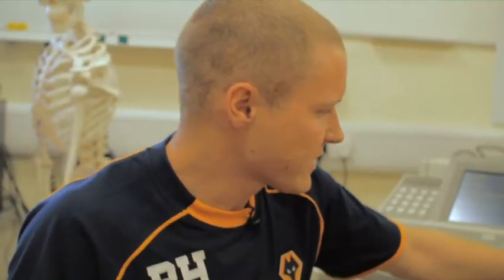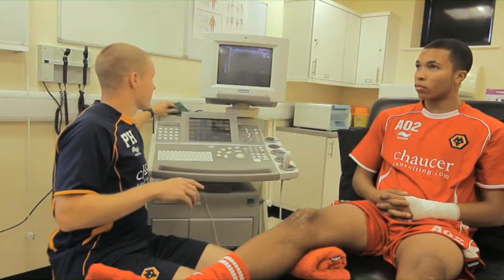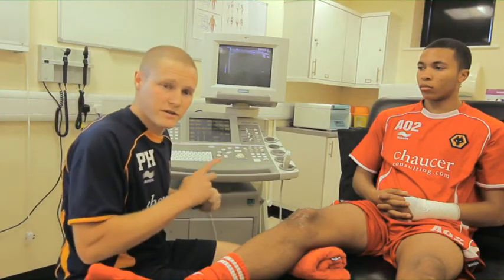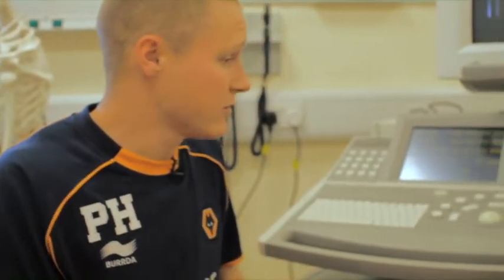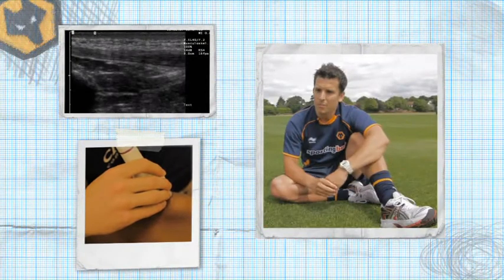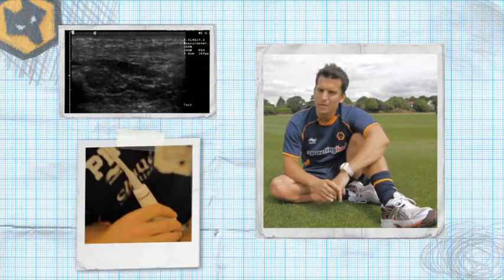We're very fortunate to have this type of equipment here, and not many football clubs actually have it. In a normal situation, you tend to have pain and you're sort of making assumptions as to what's going on in the tissues, whereas we've got the facility to look on site. The method of ultrasound is just the sound waves, so it's actually sending the sound waves through, and as they reflect back, they give a different picture, and then we know what we're actually scanning through the different images we see.